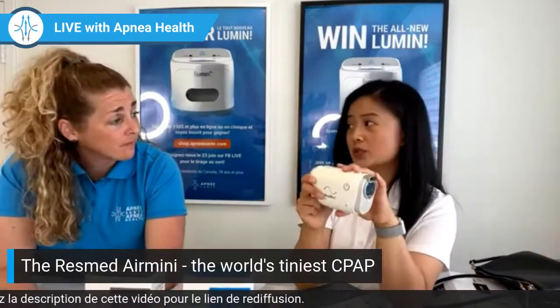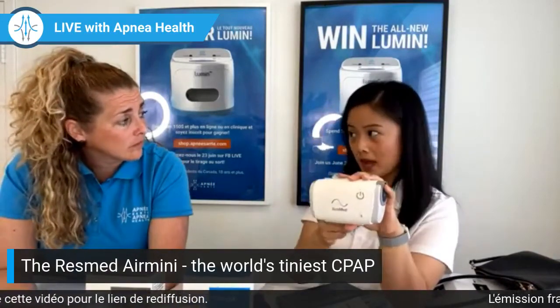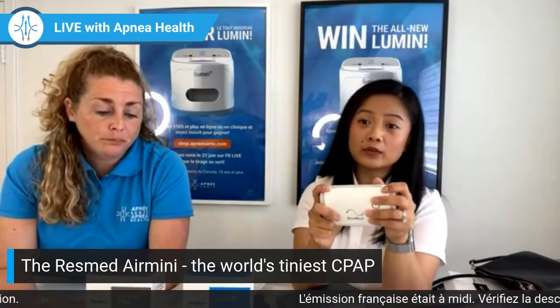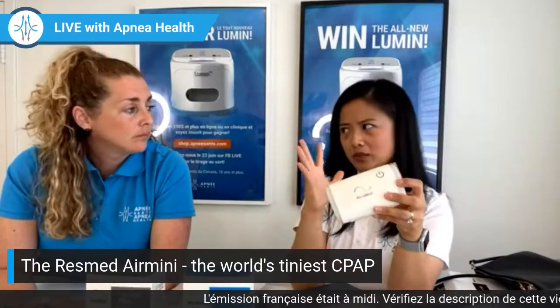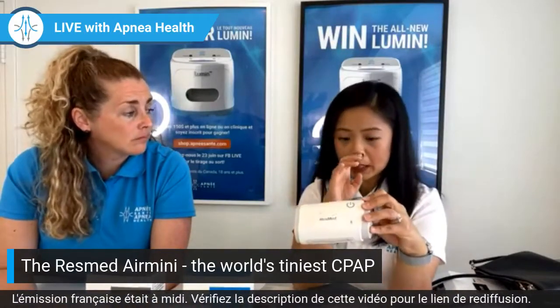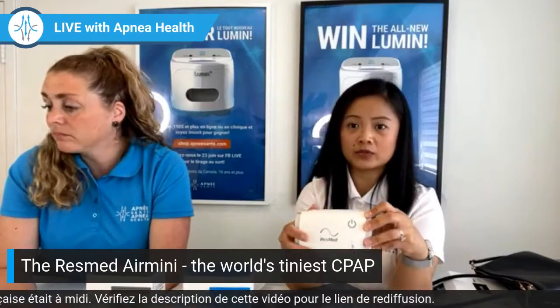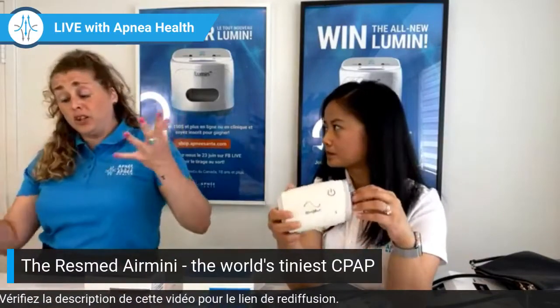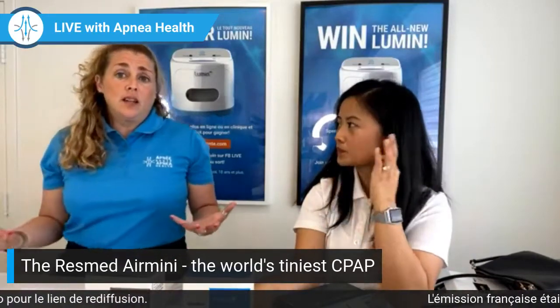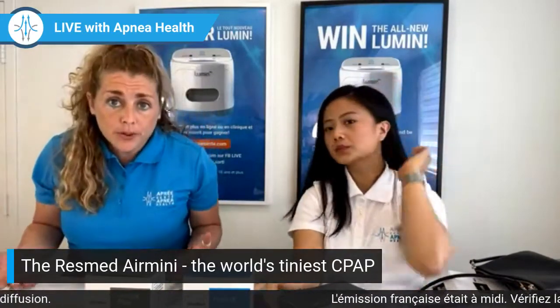It could be a very good option. But then again, selecting your mask, you have to be within your five options. Yeah. The noise level, that's one of the main complaints I get. Depends how sensitive you are to noise. But that's something common that I get from my patients. Okay, so that's good. It's good to know. I mean, we wouldn't recommend this CPAP to a new time user.